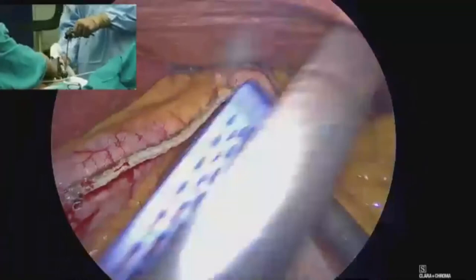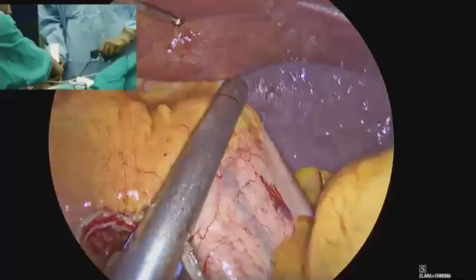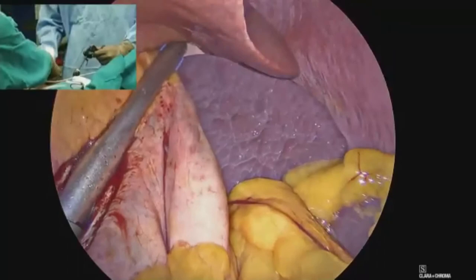Now, if we see here, this is the area of the GE junction. I'm almost there. And the best way here is, I usually would not dissect a lot close to the GE junction, but I would come and close this as I'm doing here. So that's my last firing, and I'm done with my division of the stomach.